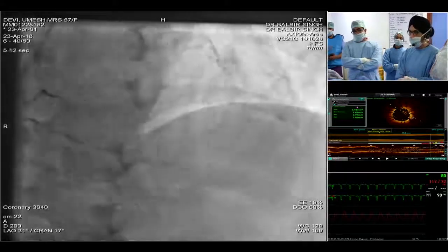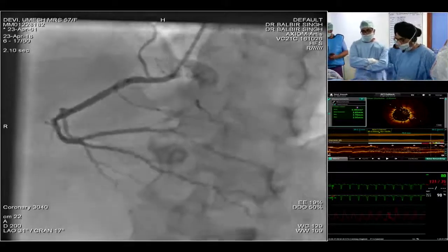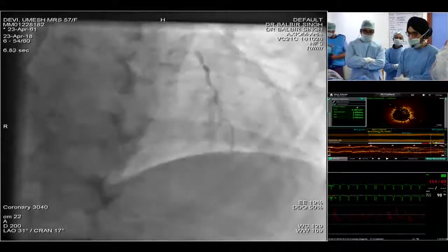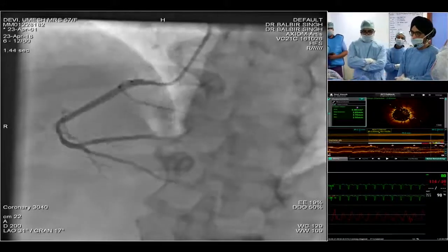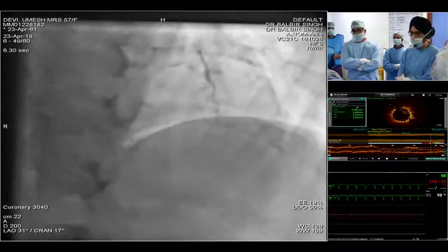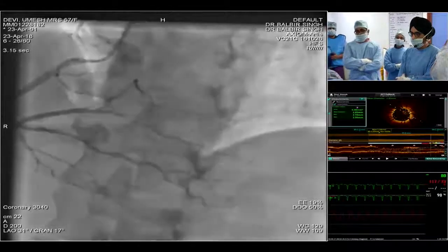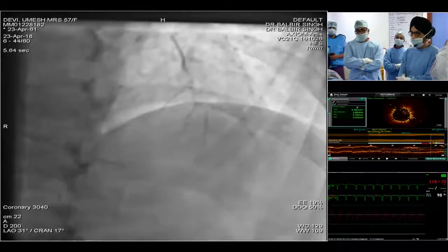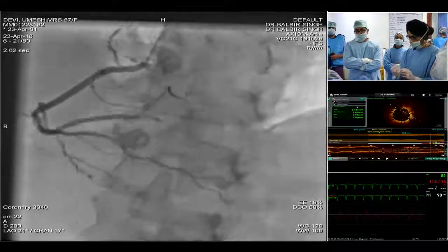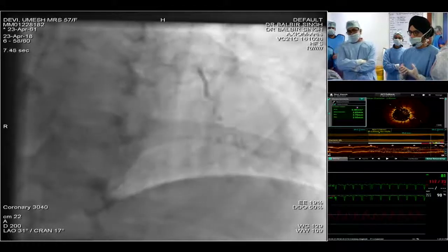Thank you. It looks like a very complex case, and you are facing very tough decisions. Personally, I think that very probably the patient would benefit the most from a PCI, but all the lesions are very critical ones. Probably the easiest is the LAD, but if I could see it well from the LAD lesion, at least one huge diagonal is coming with a subtotal occlusion in the ostium with a very short bifurcation.